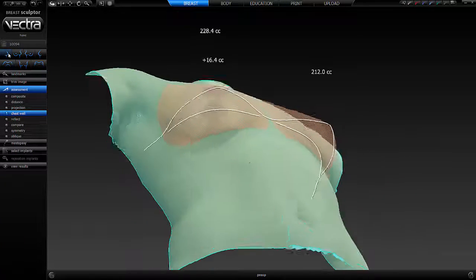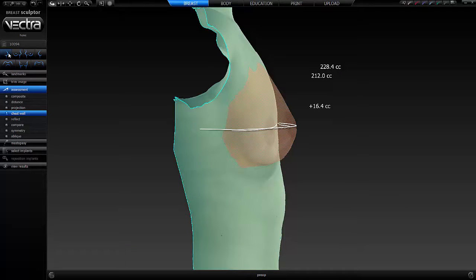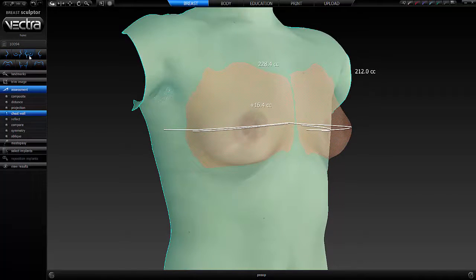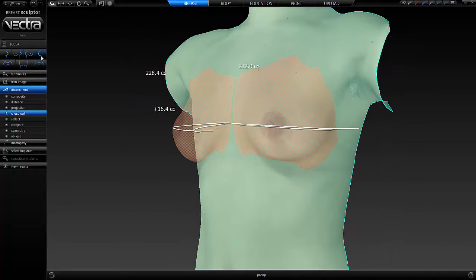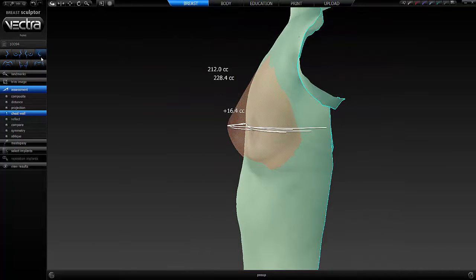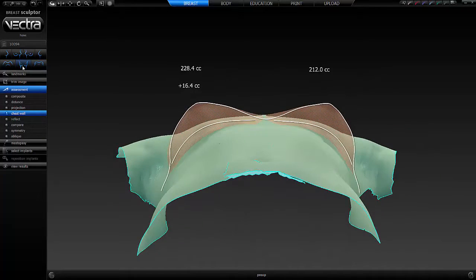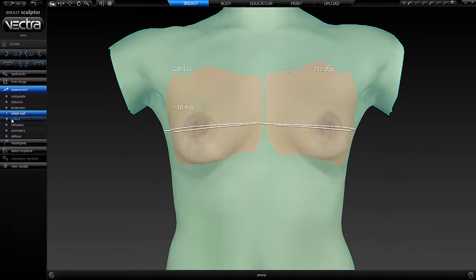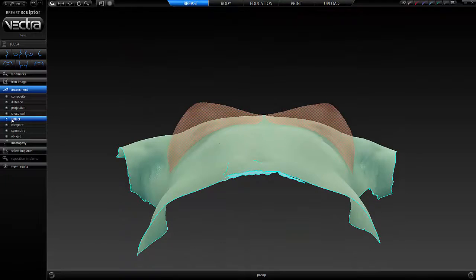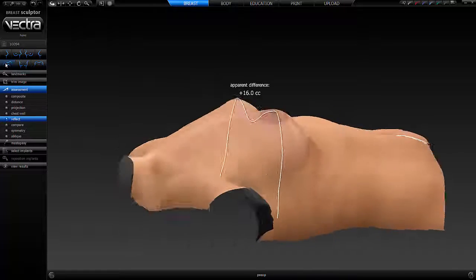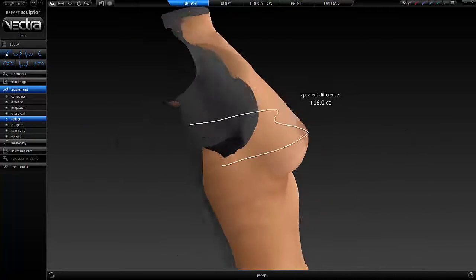One of the most critical aspects is determining the borders of the breast by separating them from the chest wall. The breasts remain flesh-colored, while the body is shown in green. The anterior and posterior borders of the breast are outlined in white. An estimation of breast volumes, as well as the difference in volume, are shown. The left breast outline is cloned to the right side to demonstrate the degree of asymmetry, and this can be examined from several different views.